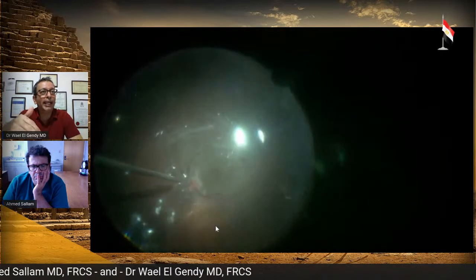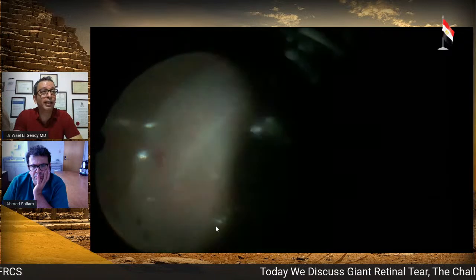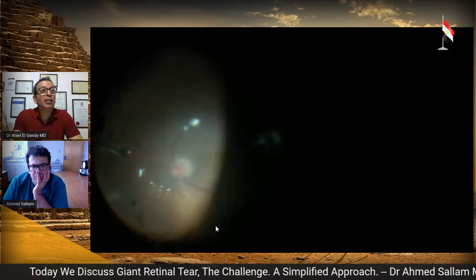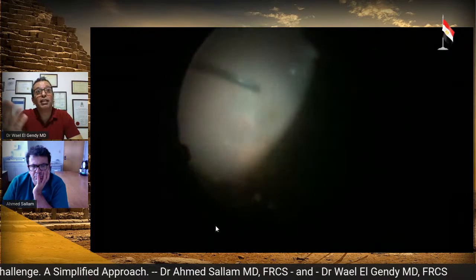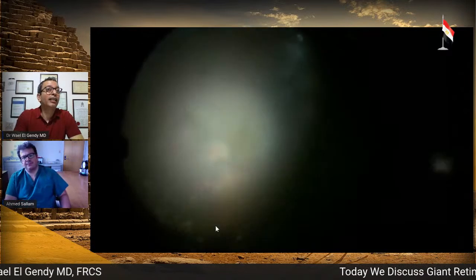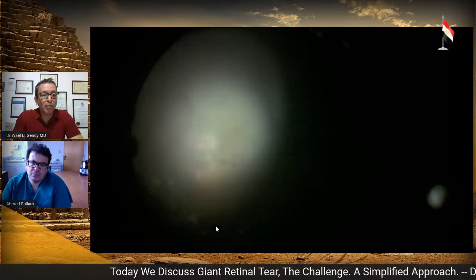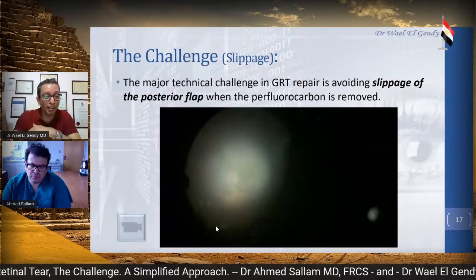And then you will see at the end of the surgery, everything was perfectly executed. And the retina is on, and everything is fine. But the problem is, to do the surgery again, look at this. The view is totally different. It's like an elongation of the procedure. The retina is on, the laser is on, and everything is fine, and the outcome is good. But the view is totally different. It's not the same as the surgery you were doing at the beginning.